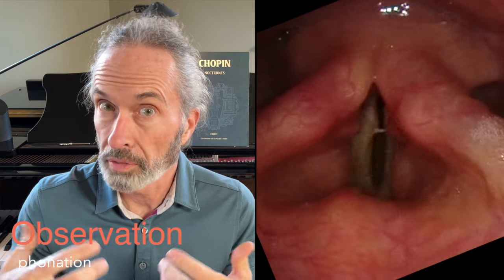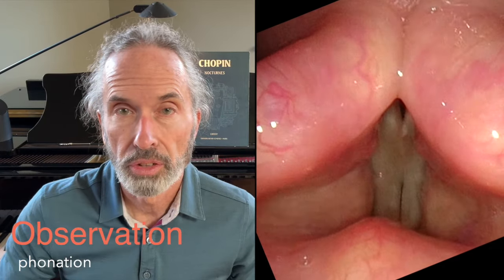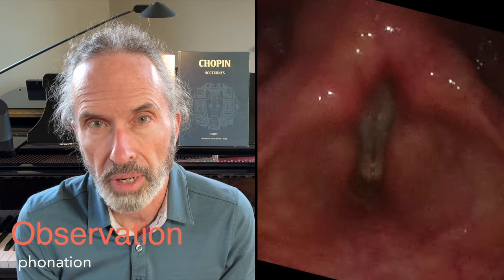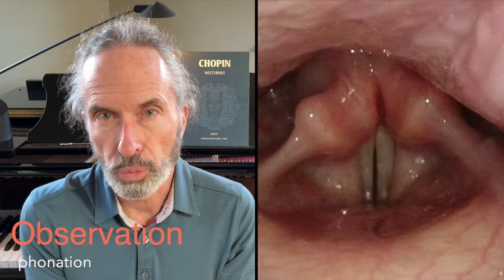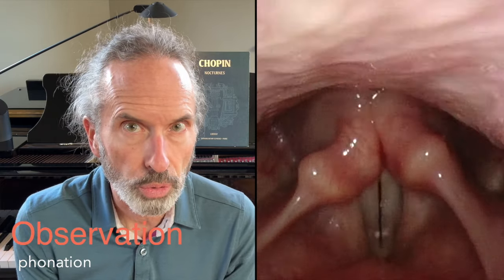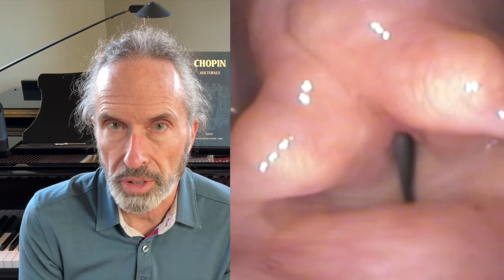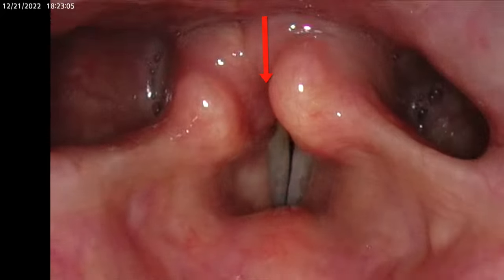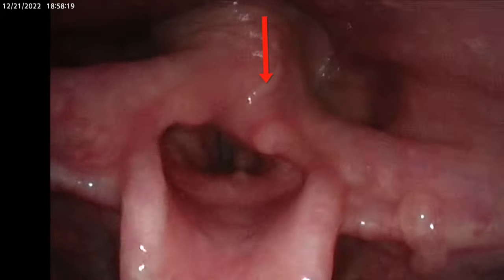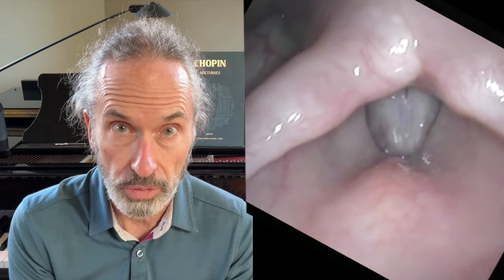We've been watching the vocal processes during respiration. One of their main uses is during phonation - bringing the vocal cords together so you can blow air through and make them vibrate. And this is when we most want to see them for causes of hoarseness. However, many times the view is obstructed by the arytenoids. The arytenoids sometimes are tipped forward and cover up the vocal process that we've been wanting to look at.